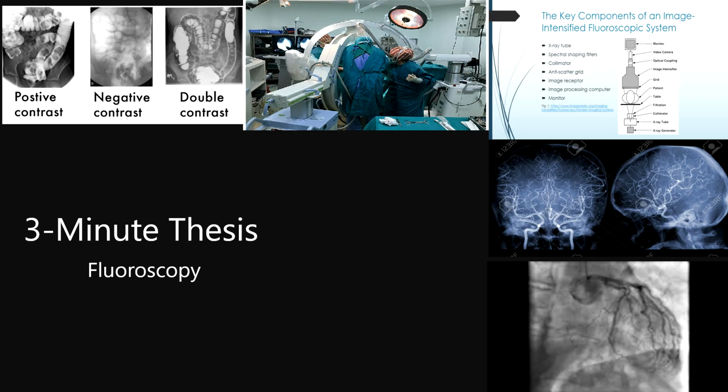There was another study done in February of 2024 to determine if using double C-arm fluoroscopes reduced the amount of ionizing radiation needed to get the images. The study involved 30 patients with femoral neck fractures and divided those patients into single-arm and double-arm groups. The study concluded that using a double arm to shorten the operation time is an effective method for reducing radiation exposure. Although the results of that study seem positive, more research needs to be done on a higher scale to test the consistency of these results.